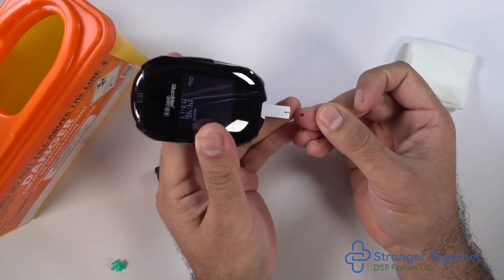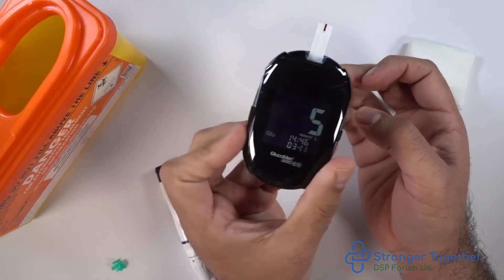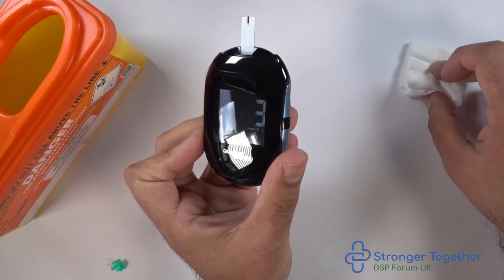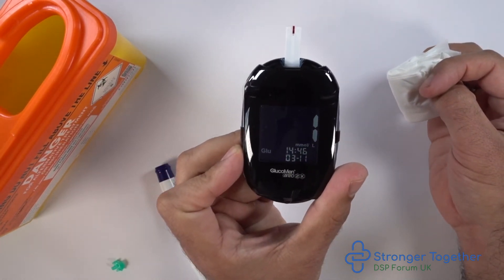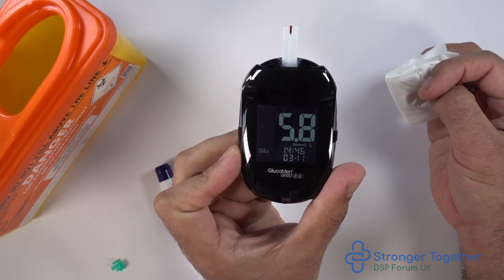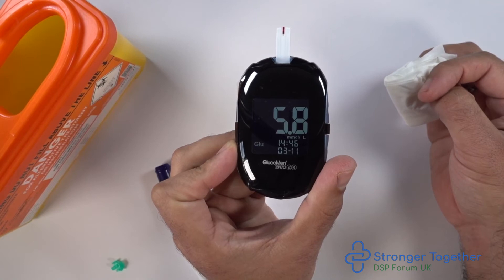We then place the meter with the strip against the finger where the blood drop is located. As you can see, the test strip draws up the blood automatically. Take your tissue and hold it between the finger you drew the blood from and your thumb. If you drew the blood from your thumb, hold the tissue between your thumb and your forefinger. We now have our reading shown on the screen.